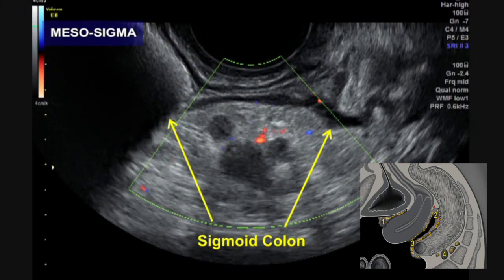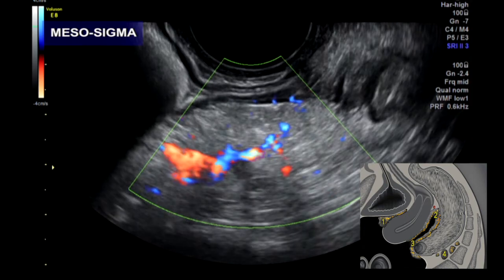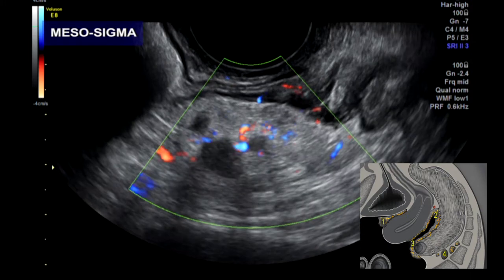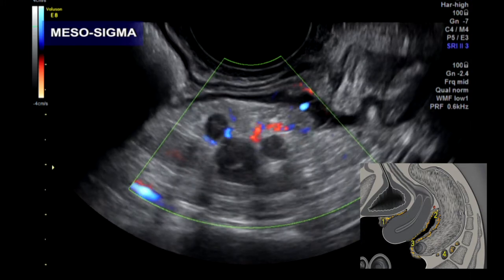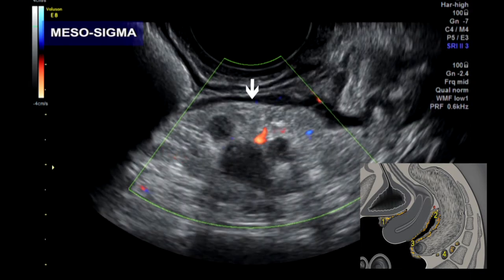Lastly, we move to the mesentery of the sigmoid colon, where hypoechogenic nodules are contrasting nicely with echogenic mesenteric fat tissue. You may be asking how we can tell where exactly the mesentery is located — it is right here between the posterior wall of the sigmoid colon and the sacral bone, which is typically presented as an echogenic line.